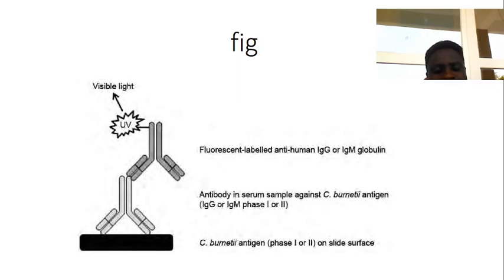They first form IgM, and then the secondary reagent is added: fluorescent-labeled antihuman globulin or other immunofluorescent labels with dyes that are easy to see under the ultraviolet light.